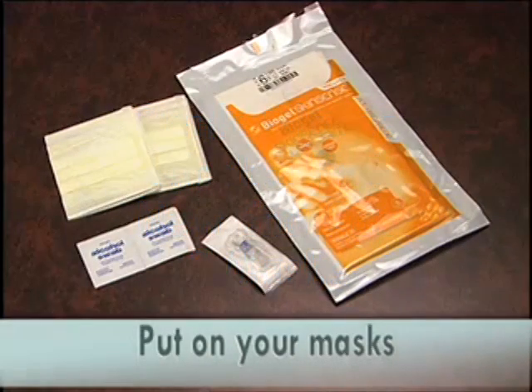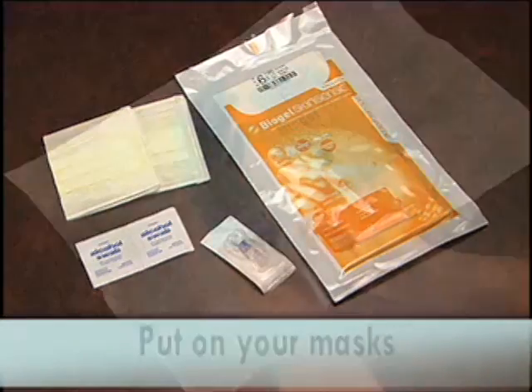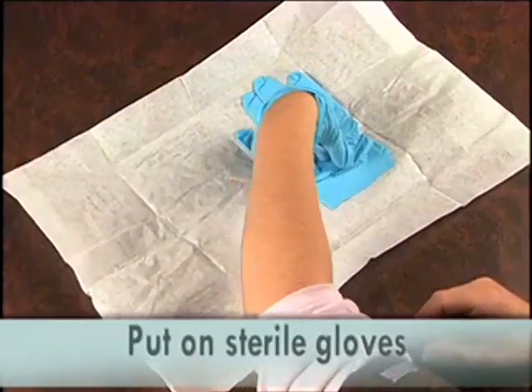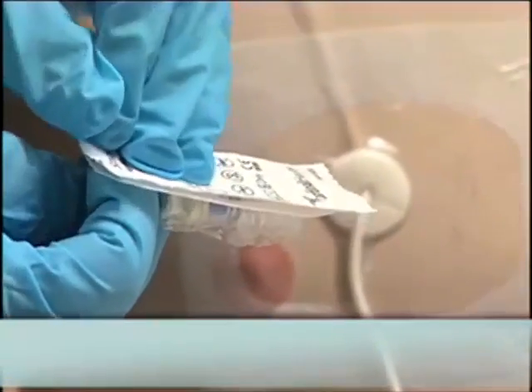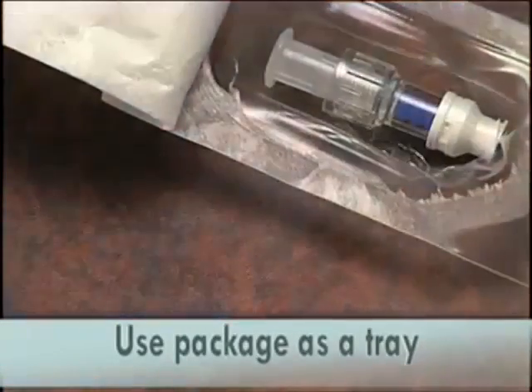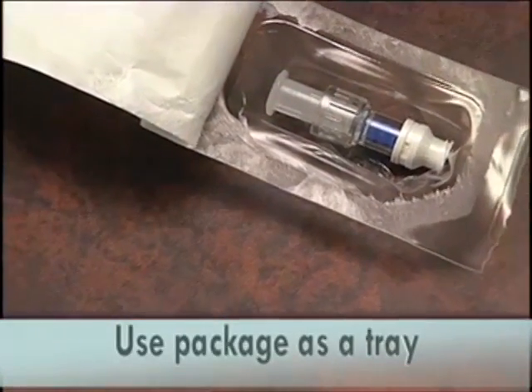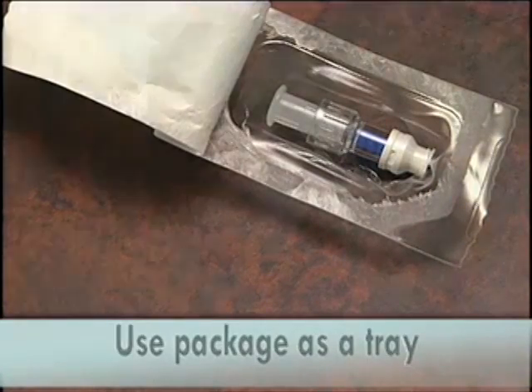Put on your mask. Your assistant needs to don a mask as well. Put on your sterile gloves. Open the end cap package and set aside using the bottom of the package as a tray. Be careful that the cap remains in its package.